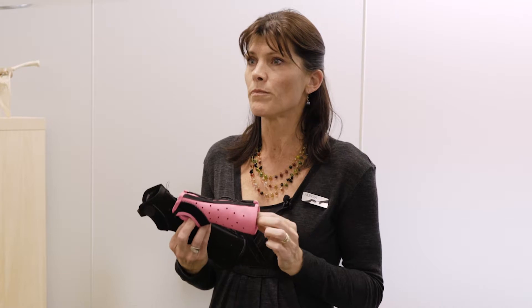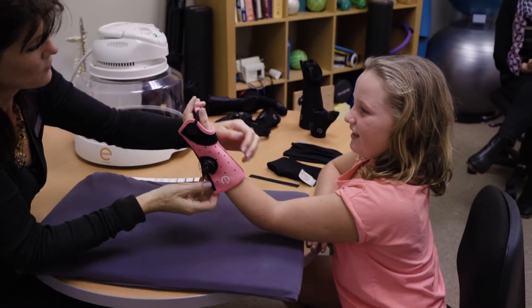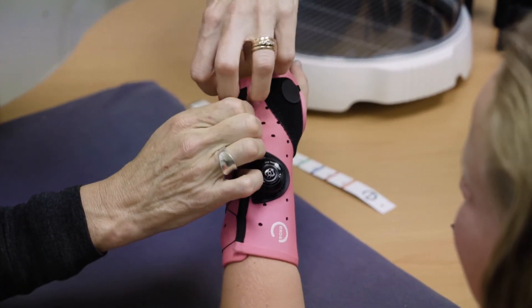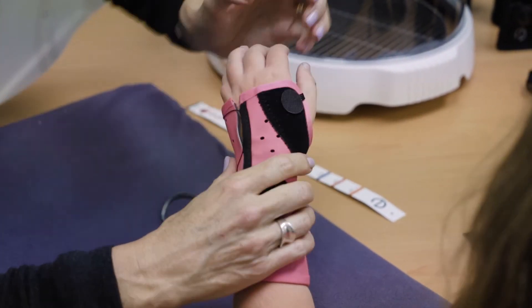They're a great option because they are removable but you can lock them in place if you need to. You can mold them particularly to the client, to the little person's hand, and they've got a BOA system that helps them to tighten up to give a really good firm cast, but they're also waterproof. So for the little ones they can still go swimming, they can still bath and shower as normal, and it's easy enough to just loosen it off, dry underneath it and click it back into place.